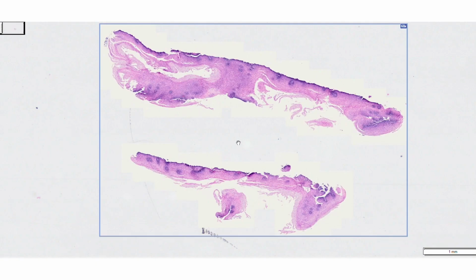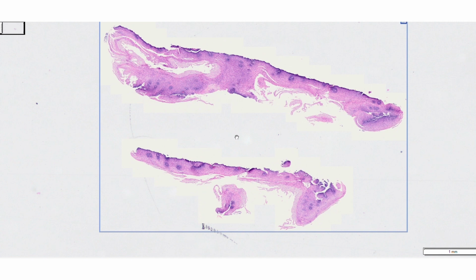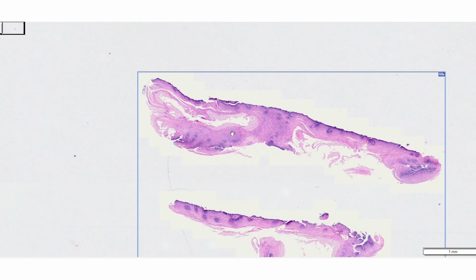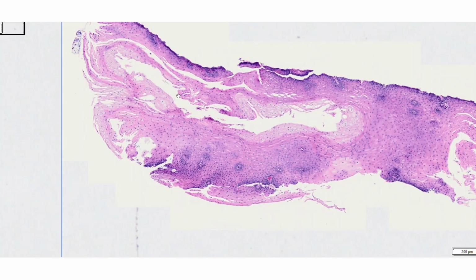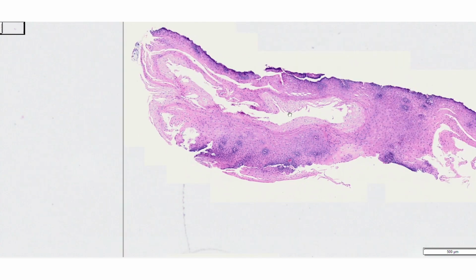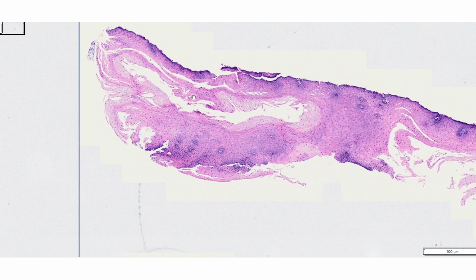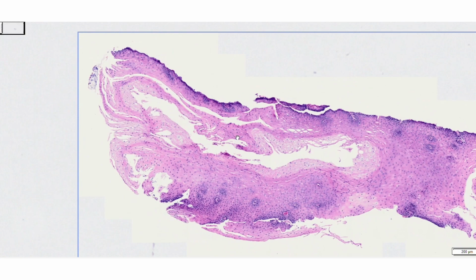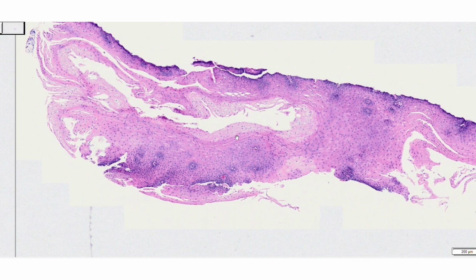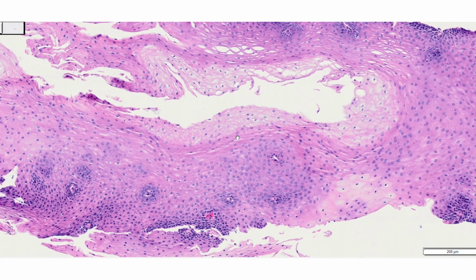Just quickly here, this is also the mid-esophagus, and I just want to point out how incredibly abnormal this architecture is here. Even though you can tell that the cut was split, the reason why that happened is because there is something abnormal in the tissue that has a different density, and it caused the knife to cut it at a different angle.